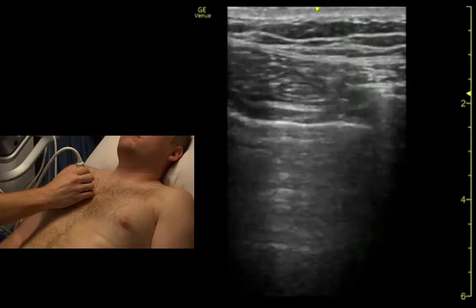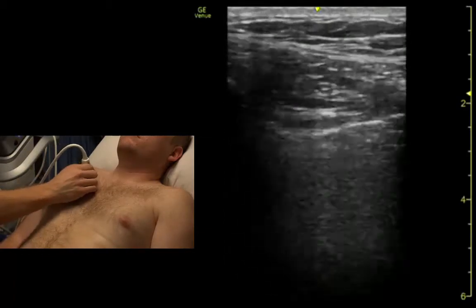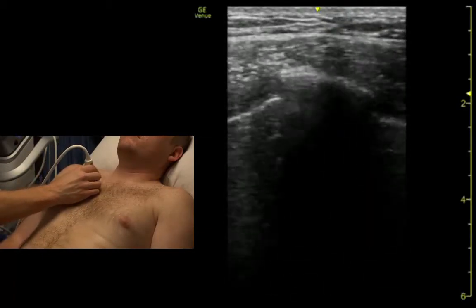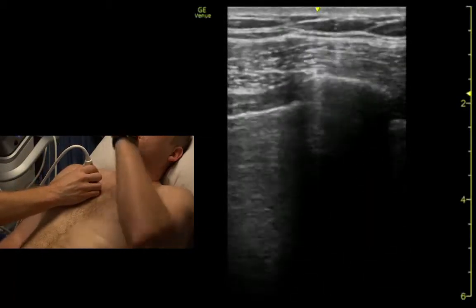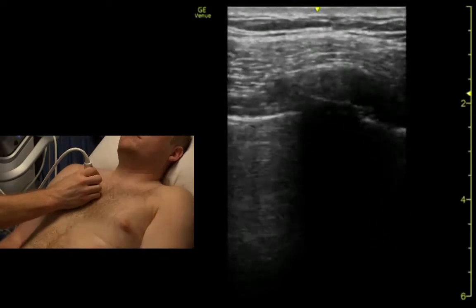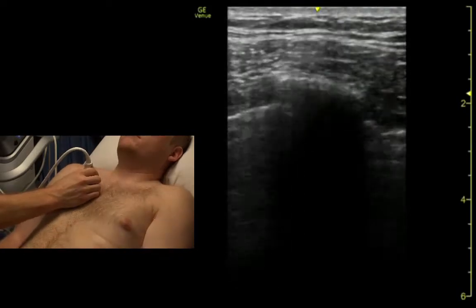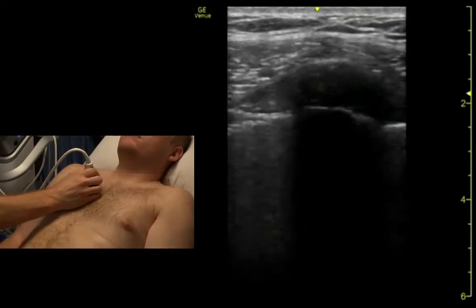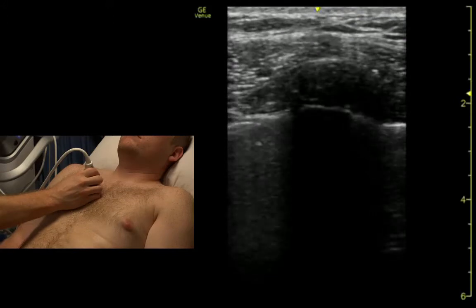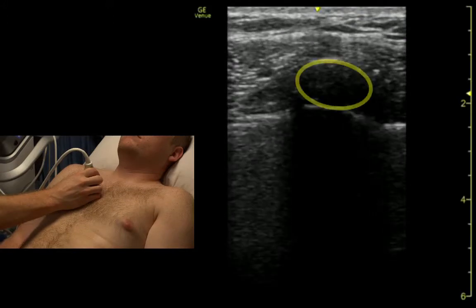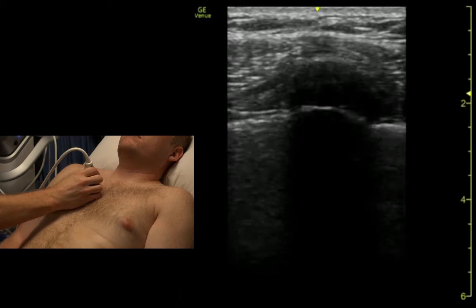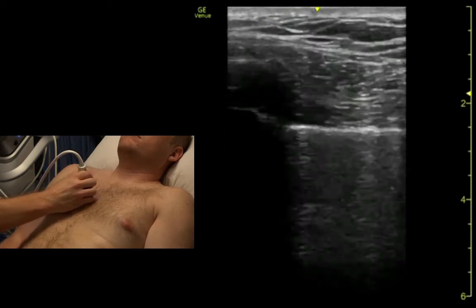If we slide in far enough on the rib, we get on the rib here. If we slide in far enough, we can see where it transitions from bony to cartilaginous. And then we can see the lung sliding all the way underneath.